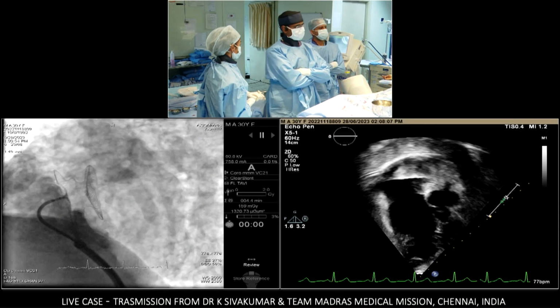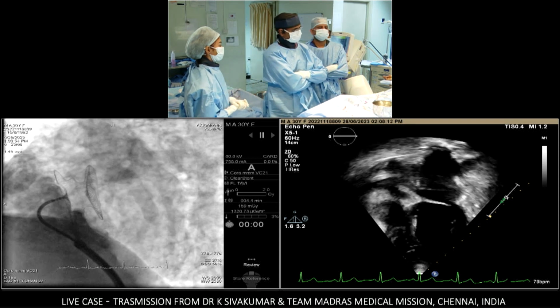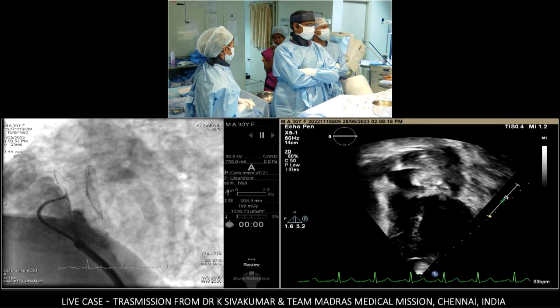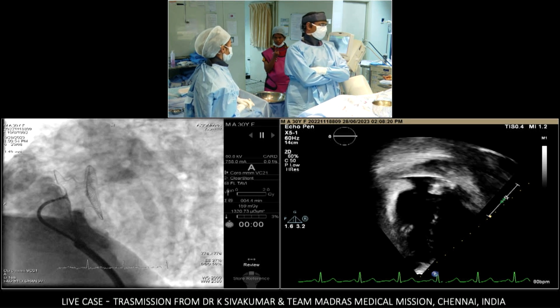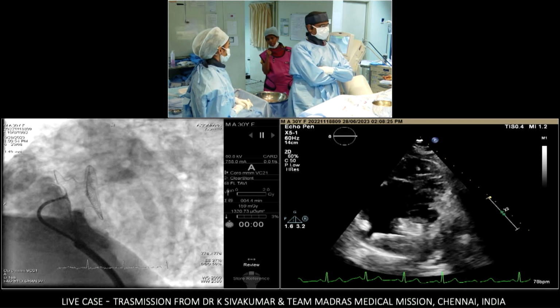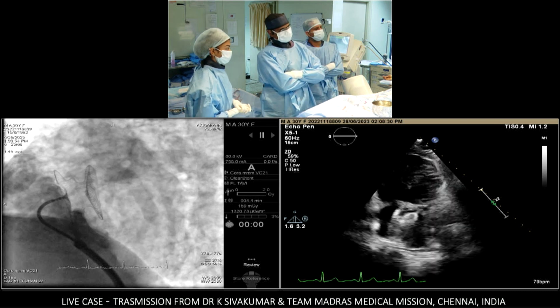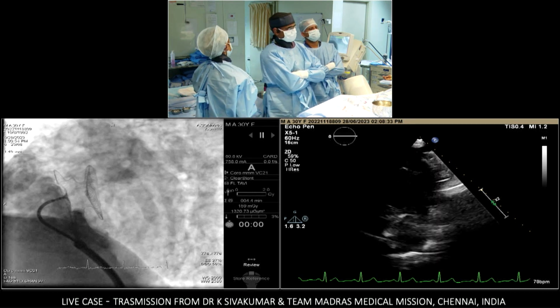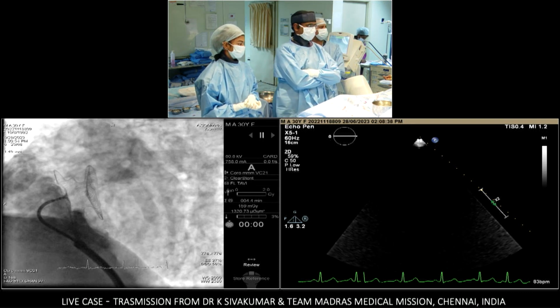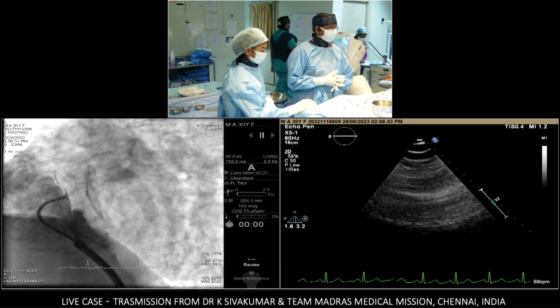So you get this big splay and you end up with 2 problems. The first is the device may embolize, might milk itself out because the waist has become cotton reeled, or the disc then leaves a gap and you get a residual leak, both of which are really difficult to sort out one way or the other. And I think the point of this device, if it's specifically for this offset septum, is to create a second layer within the waist area to stop it from milking itself out, but at the same time fill the whole hole. So you essentially oversize, which is what we'd like to do with our devices normally, but we can't because they will definitely cotton reel out if we did that.